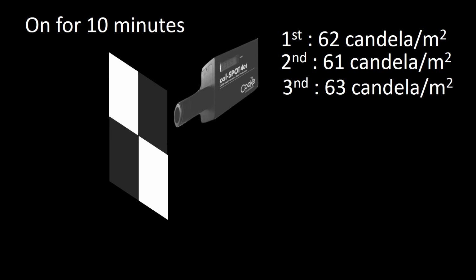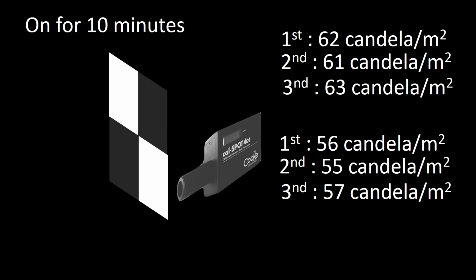We previously mentioned the mean luminosity of the checkerboard, which is done by sampling white and black checks. The process to determine Michelson contrast is the same, but as you will see, the math is a little bit different. We measure the blacks and then we measure the white squares.